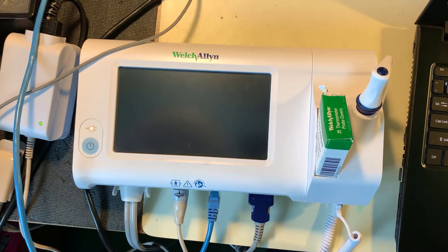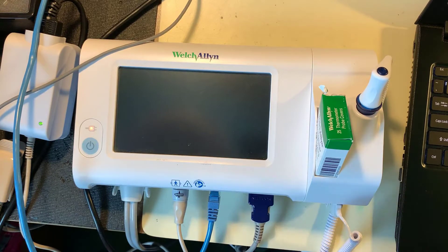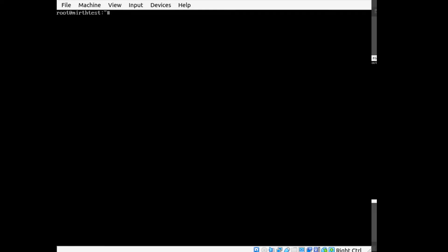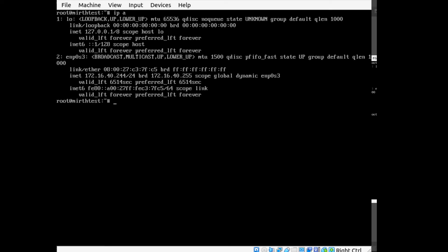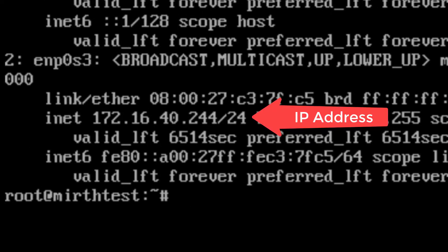Okay, so now back to where we were before. Go ahead and connect the Welch Allyn to our virtual machine. So on our virtual machine, we're logged in. We can type in IPA and underneath here you can see our IP address under INET. So mine right now is 172.16.40.244.